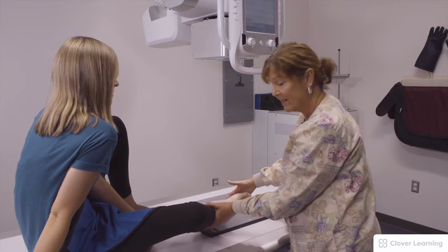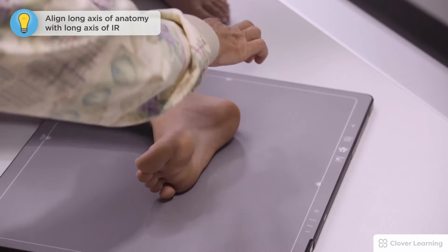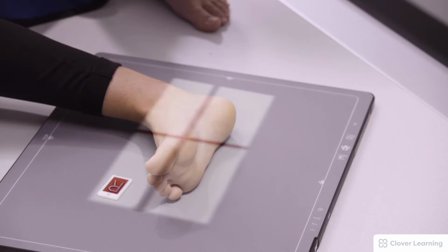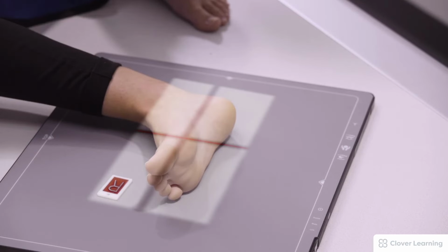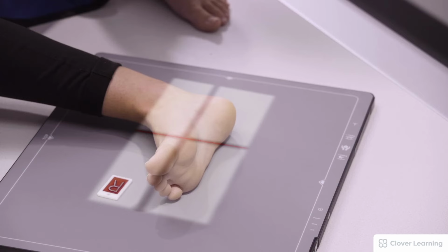We want to flex the foot, and we're going to bring your knee all the way over, so you're going to roll through your hip a little bit. So we are turning the IR, so the long axis of the anatomy is with the long axis of the IR. Central ray is at the base of the third metatarsal. Keeping the collimation open at about 1 inch on either side, leaving room for the marker. And you will see the foot in profile here. The patient needs to hold very still.